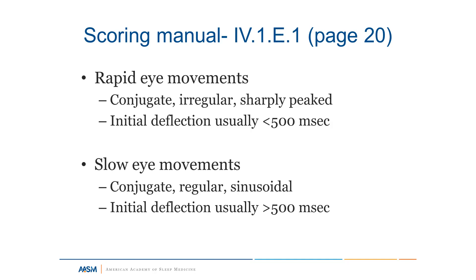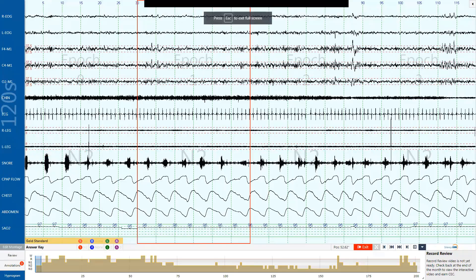I'm going to switch between these PowerPoint slides and the ISR itself. This is the ISR interface — to orient you, you'll log in through the ISR program, each with your own individual account. You'll be able to score one 200-epoch record every month, and you'll also have the ability to look at archived records for additional practice. I'll orient you to the screen and talk about some of the keys you'll use for the scoring interface.